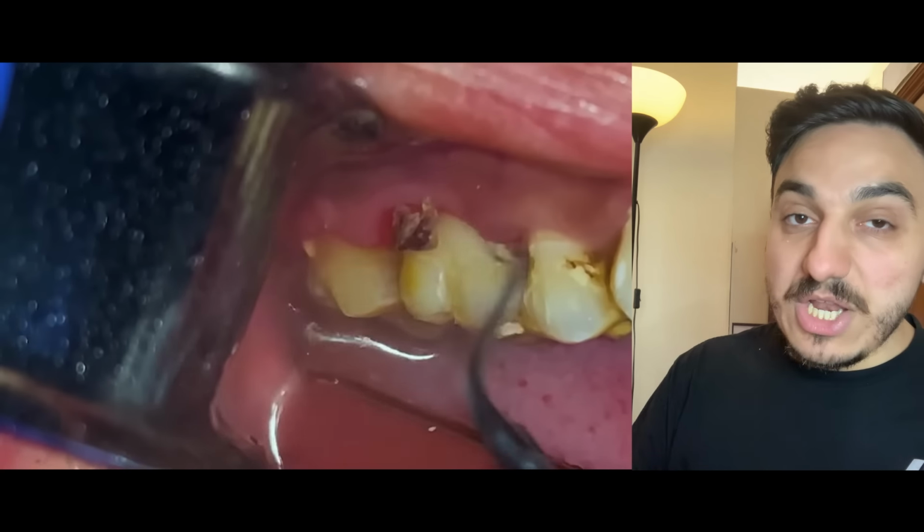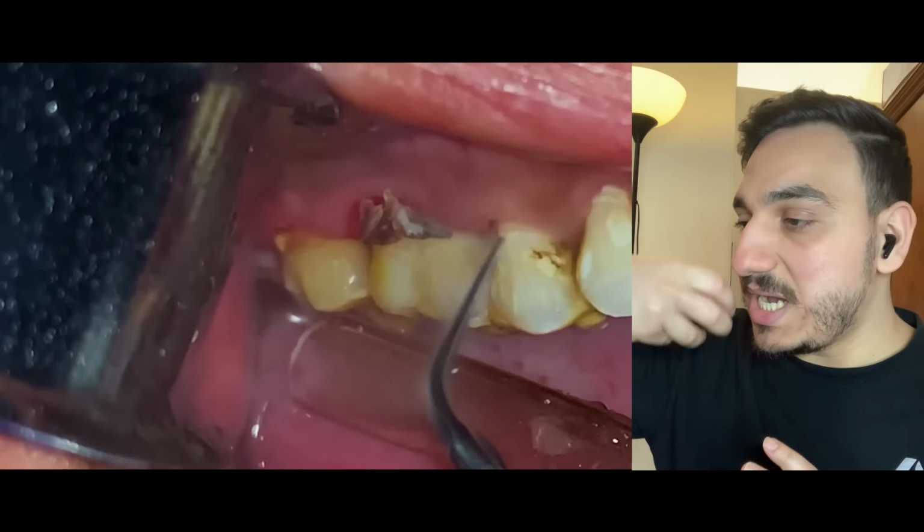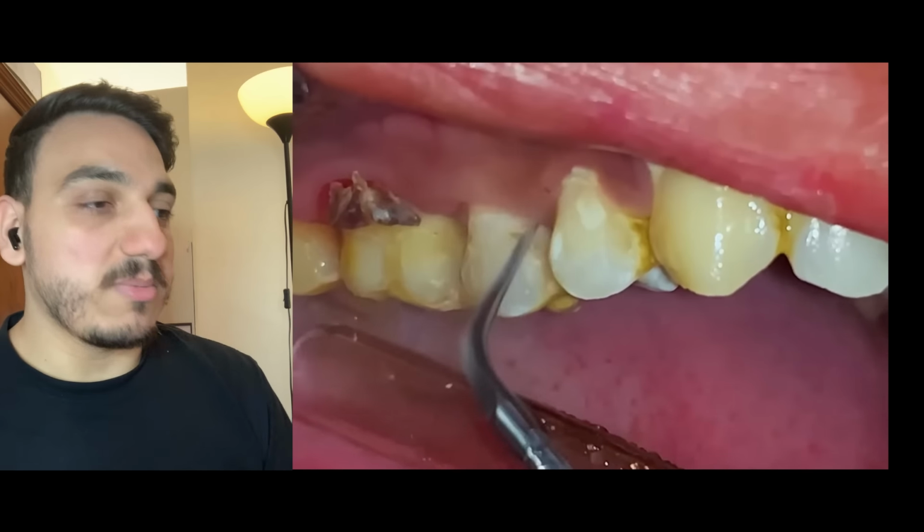Stick with me to the end of the video because we will also see the removal of that huge dental calculus, which you saw probably in the thumbnail.